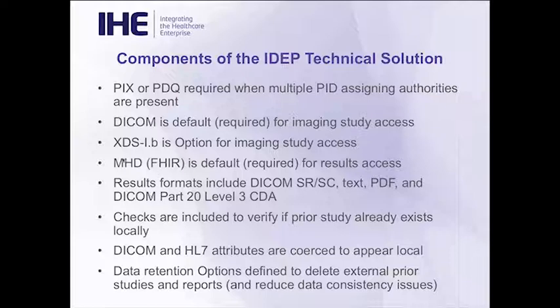The report format, Terry, this is Lynn, is that both query and retrieve using MHD? Is that correct? Yep, that's our query plan, for query and retrieve. Okay. Yep. And even send, for that matter, kind of forward.